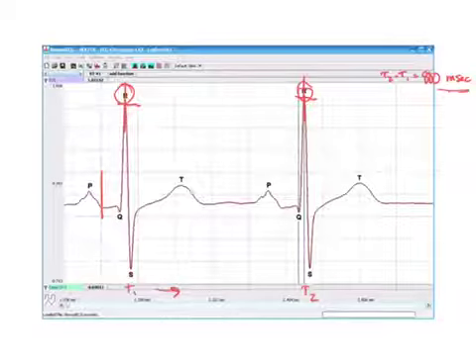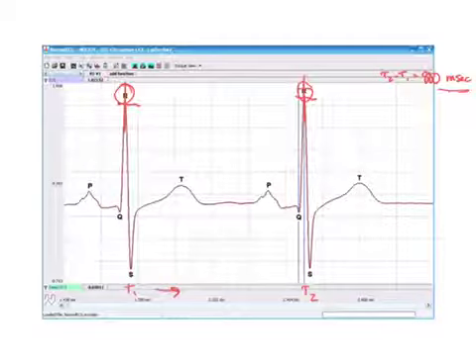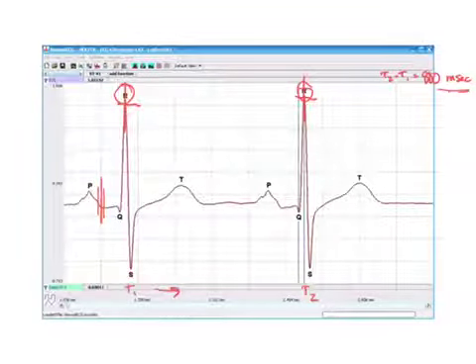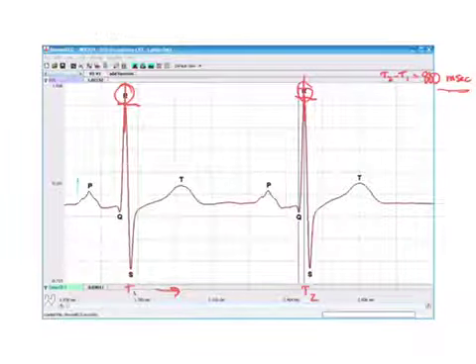If you do not flip-flop, unfortunately what happens is you're like, okay, where did I put that? And now let's measure QRS, and then go measure T, wherever we're going to put T. And then you have to go back and figure out, where did I put this first cursor? Was it here? Was it there? And the accuracy dives, because when we look at this data sheet, by the time we're done, it's a mess.